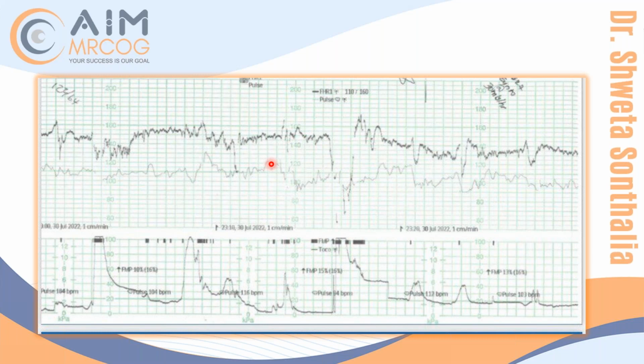May I? Yeah, go ahead. Who is this? This is Mariam. Yeah, go ahead, Mariam. It is CTG for twin pregnancy. Ah, very good. This is not a CTG for twin pregnancy. Actually, here in UK, they have this maternal trace also. This is maternal heartbeat trace. This is not twin pregnancy.